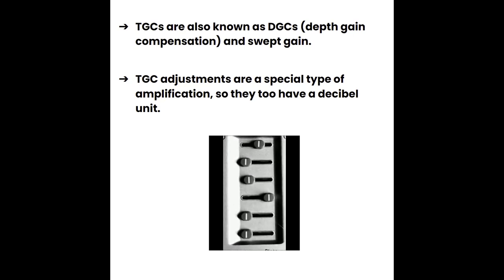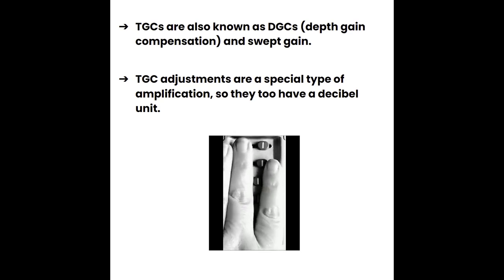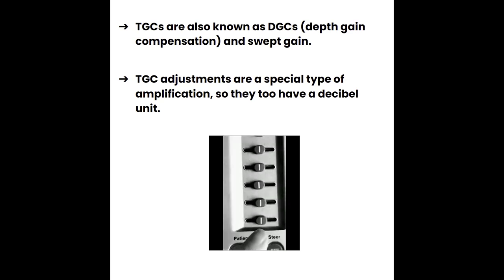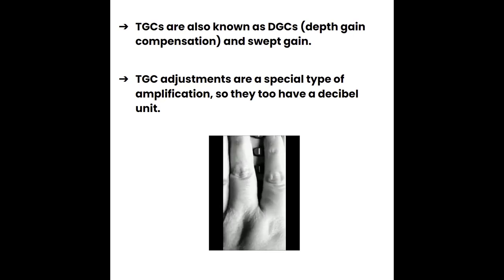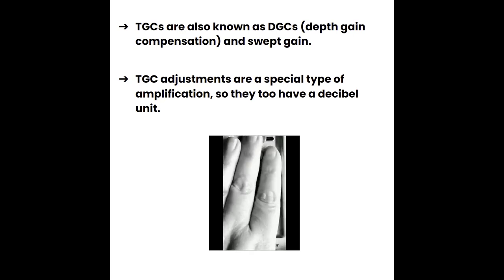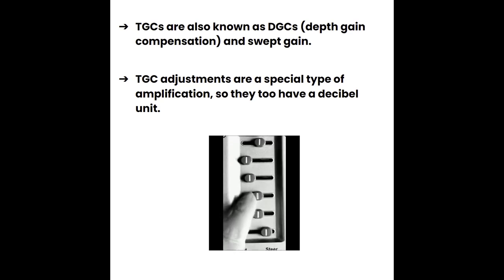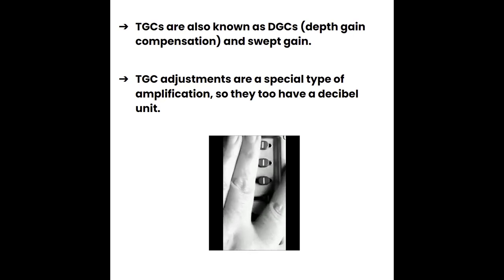It is oddly one of those very satisfying things that you're kind of doing as a sonographer. It's almost like a grounding position where you get them all lined up in the middle. But notice how, going through, you can make that gradual slope, or you can make a gradual curve. But never, ever, ever zigzag those sliders around. That is not appropriate use of your TGCs.